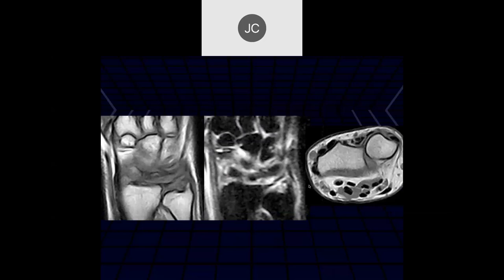Taysen: the foveal attachment is definitely torn, and there's some negative ulnar variance as well. On the axial images — remember we talked about instability — when more than half of the articular surface of the ulna is dorsal to the radius, you don't have a good articulation between the radius and ulna. This is unstable, and you can pick that up clinically.